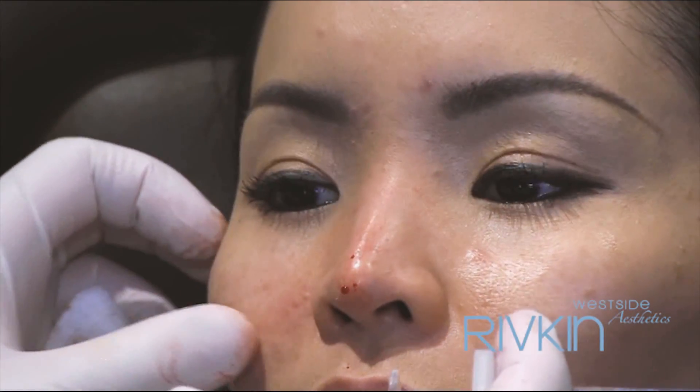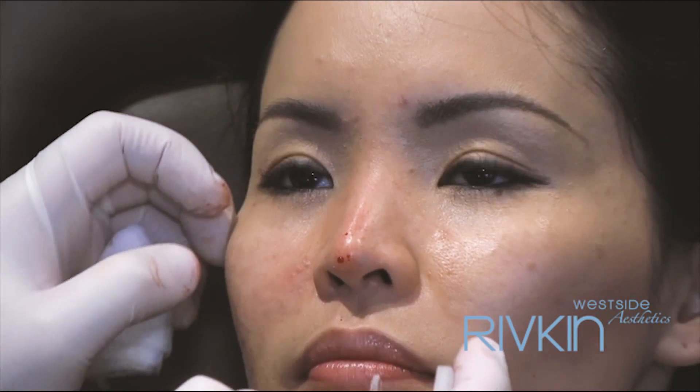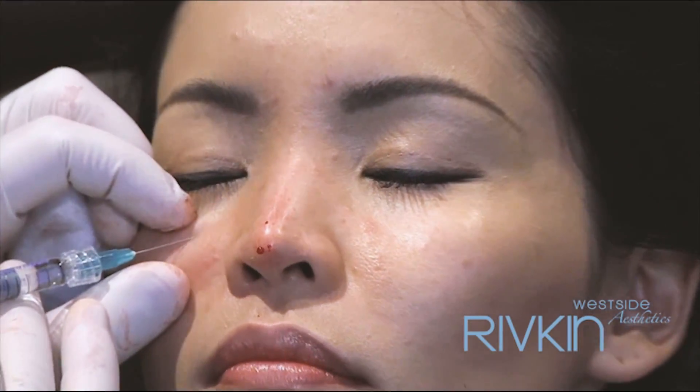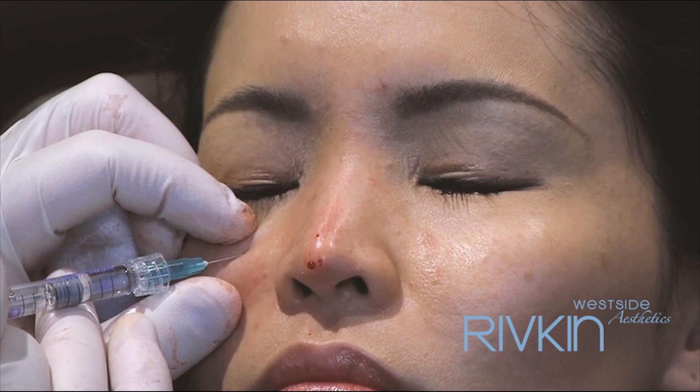Open your eyes for a sec. Ok, that's better. A little bit more — it's closed. Stick. Ok, sorry.